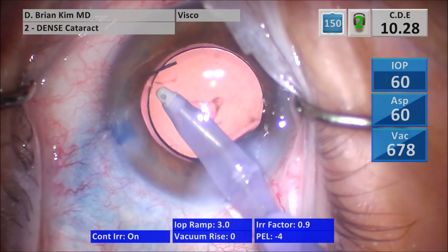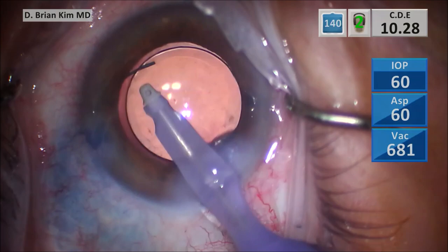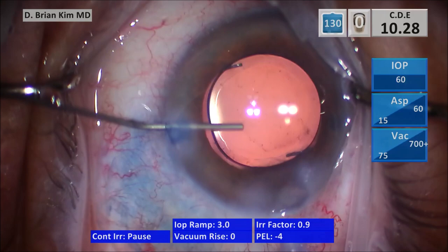So this was a very dense lens. I did a double chop, but it did cause a defect in the anterior capsule. You want to be very careful when performing a double chop not to go too far peripheral with the phaco tip when turning it vertically. It's such a dense lens that it also caused the phaco tip to get clogged, which I had to stop and free up. This was a very high CDE for me — I don't normally go into double digits — but because I employed mechanical fracturing techniques, double chop, cross chop, sandwiching and crushing the lens pieces into smaller pieces, this patient had a very clear cornea on post-op day one and was able to see 20/30 uncorrected right after surgery. I hope this was helpful, and I thank you for your attention.